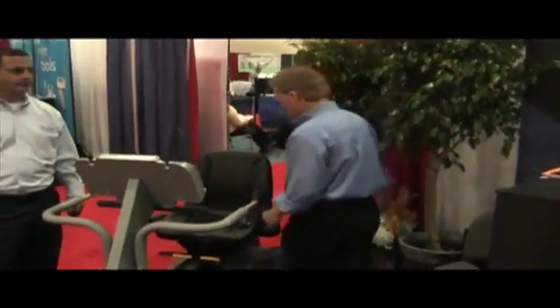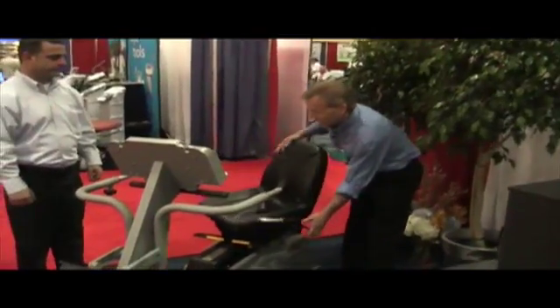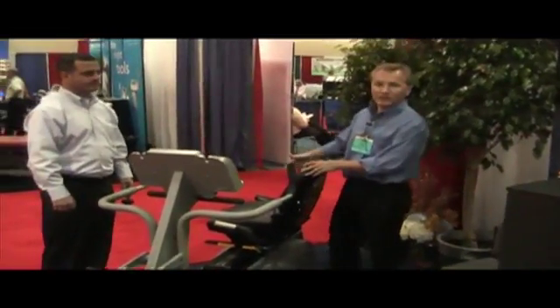We have a nice rotating seat so it's very easy for the patient to get in and out and do a wheelchair transfer.